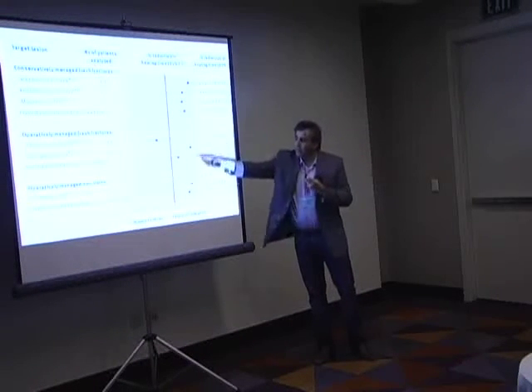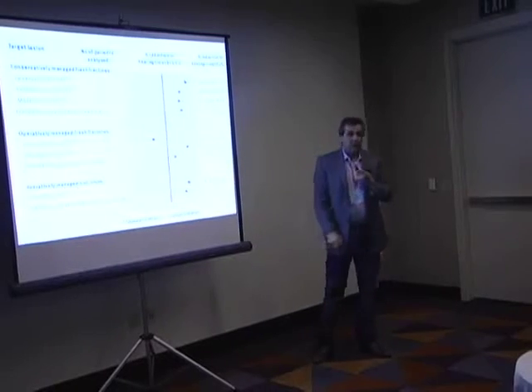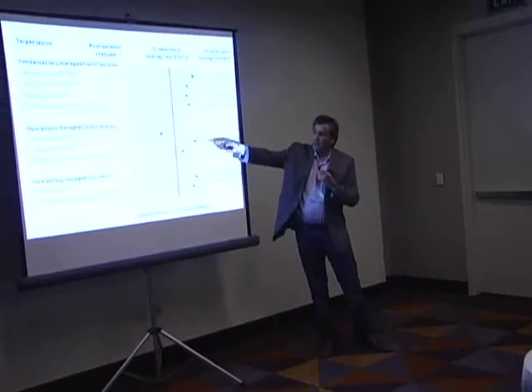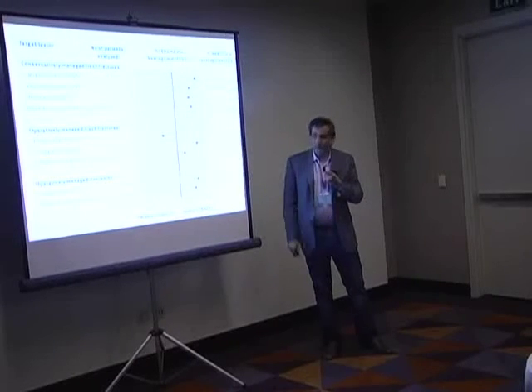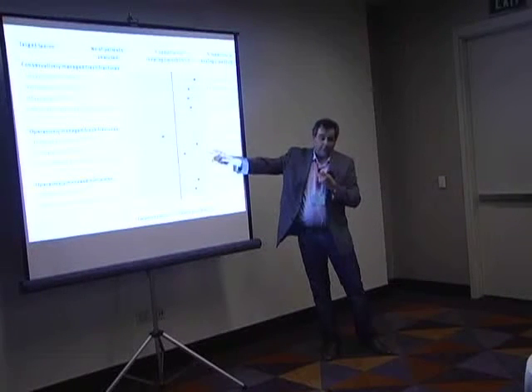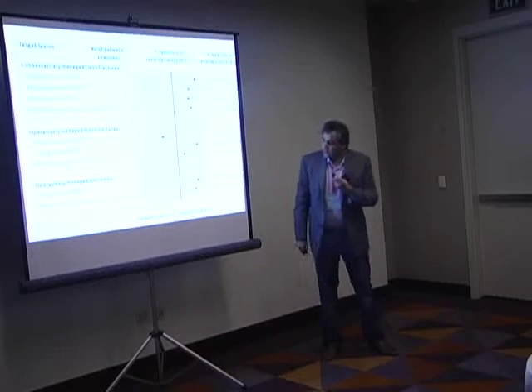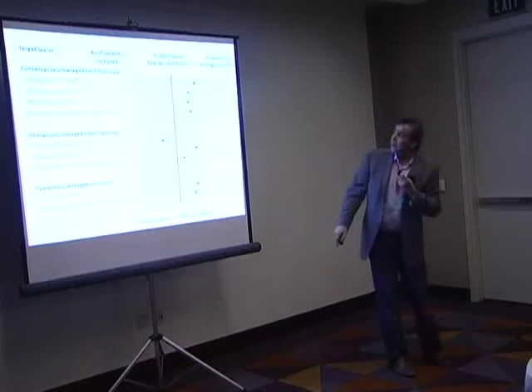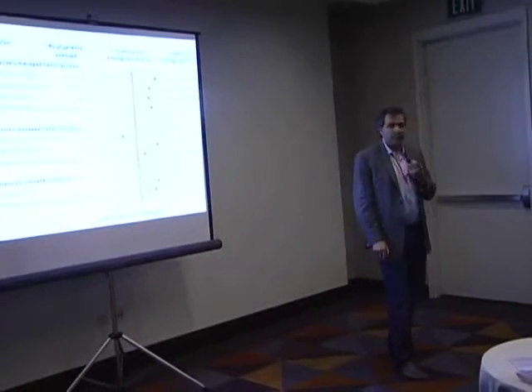The challenge, though, was in this area, operatively managed fractures. When you put a device in, whether it's a nail, and these are tibial nail studies, there were completely divergent results, which made the study we did, TRUST, valid and important. And the non-union data, while encouraging, was really only a few studies of, as you can see here, 21 patients, so small numbers of patients.